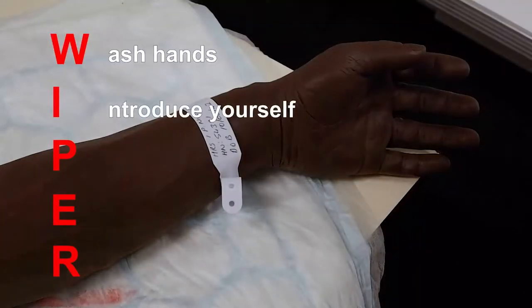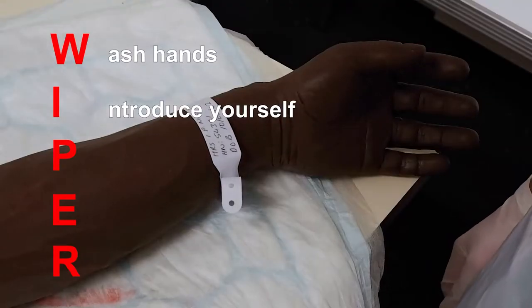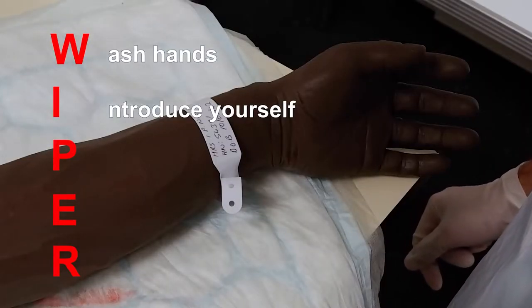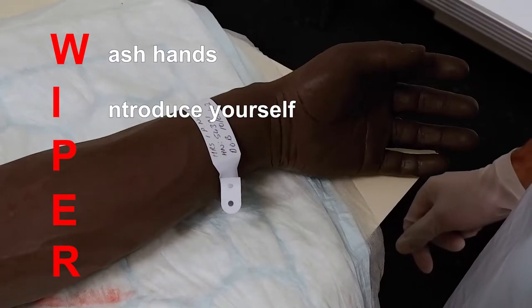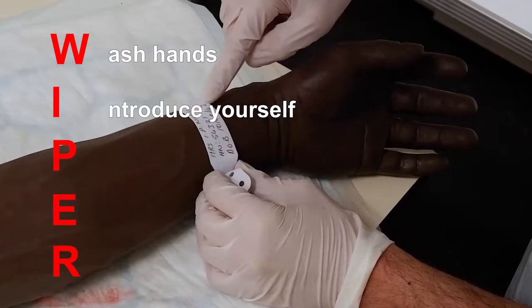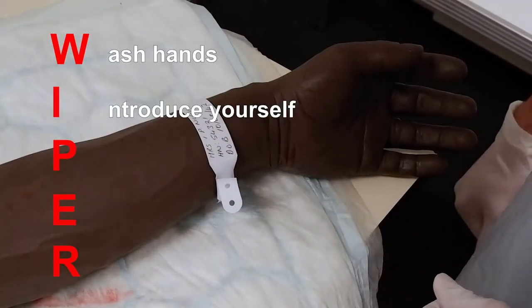Introduce yourself to the patient, stating your full name and role. Ask the patient to confirm their name and date of birth, and confirm if they have any allergies. Ensure that you check all of these details on the hospital name band.